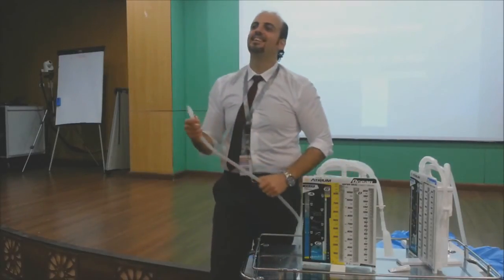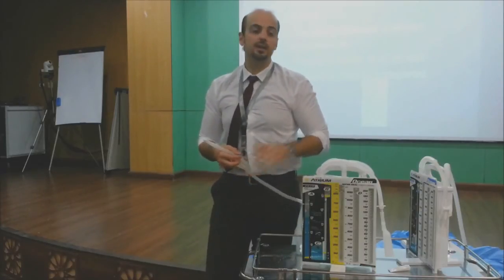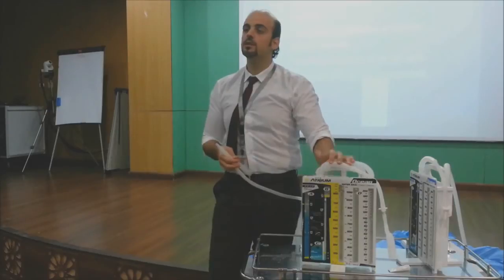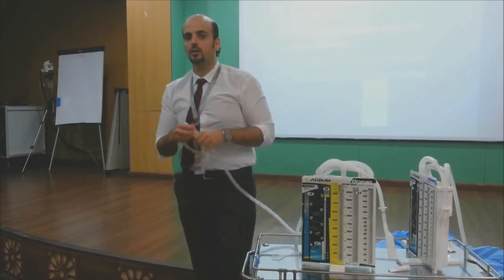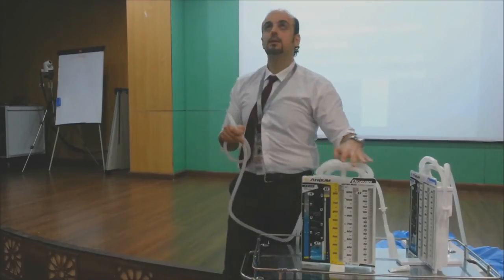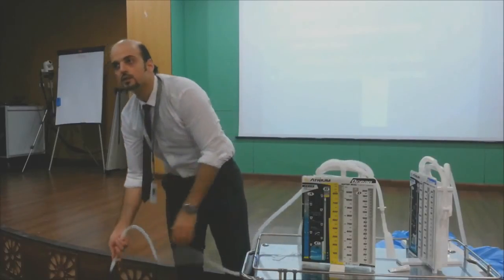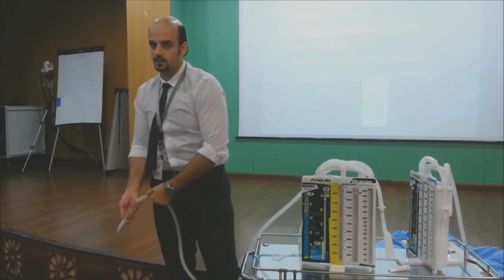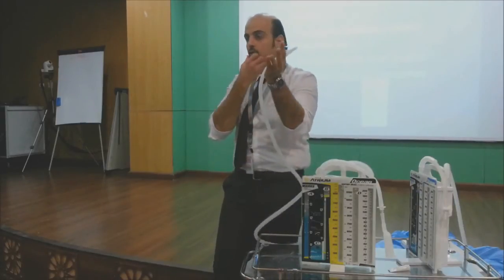The child will have no valve, but this one has. No valve, there is no valve here also. This is not a valve. The valve is the water only. The water prevents the air because the water is heavier than air. But if the water is up there and I suck and put like this, the water will come inside. This is a very good question.